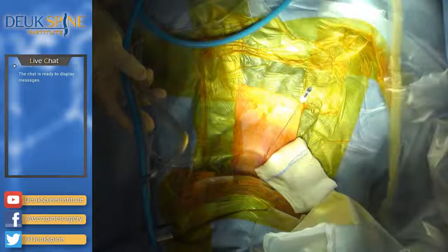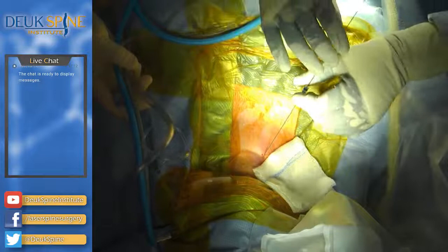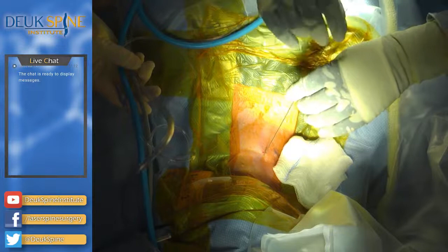Our patient is asleep. This is the front of his neck. His Adam's apple is here. And by the way, he has an absolutely beautiful neck. We like long, beautiful necks because they make the surgery go a little easier. All right, you can bring his blood pressure up if you want to get him around 100, 110.